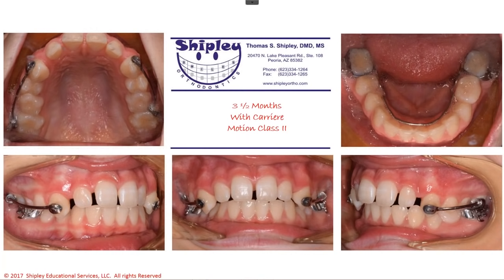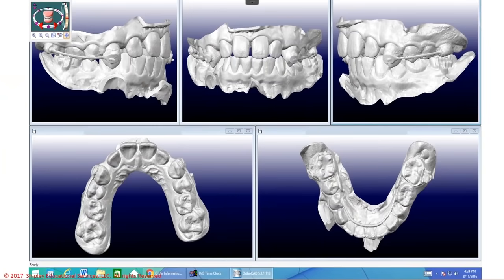with the appliance on, and then I have Invisalign virtually remove the motion appliance for me, or the distalizers for me. So we're going to scan it in this way. They're going to digitally remove those and make the trays. That works like a charm almost all the time. We leave it on, then they come back the day of tray delivery. We take the appliance off, and then we give them the trays, and they fit perfect.